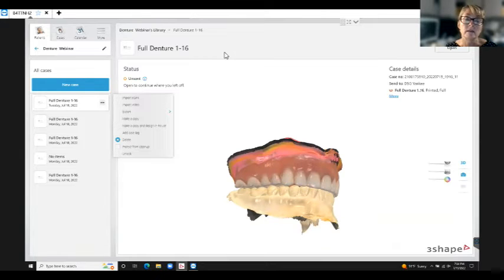Now, if you're doing the reference denture, like Bannister just scanned for us, when you put the heavy body and light body impression material in the denture and you insert it, you're going to have the patient do their AEIOU, all the things you would normally do for border molding, to help acquire their specific muscles and anatomical landmarks for fabrication.